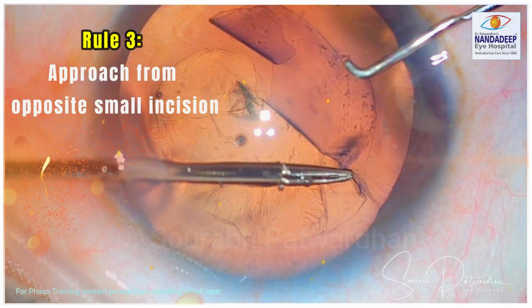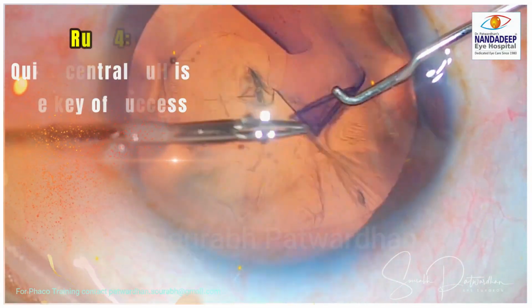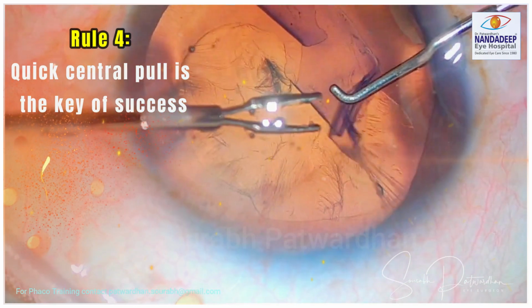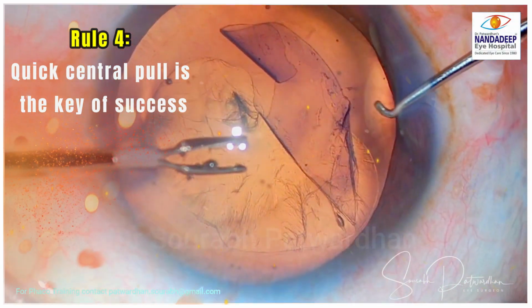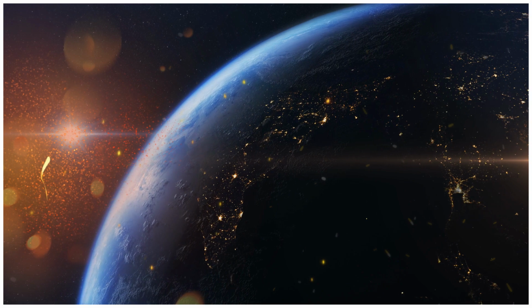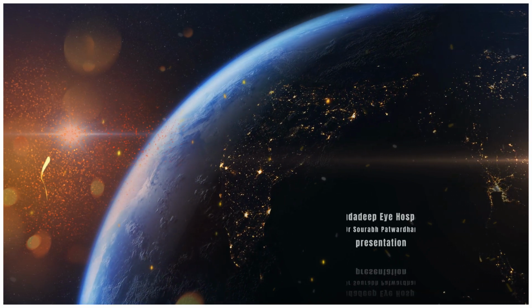The third rule is approach always from the opposite incision and from a small side incision to keep the anterior chamber maintained. And fourth is that quick central pull is the key of success, so do not hesitate to pull it quickly. So let's bring it on and bring it in with the rules of the game.